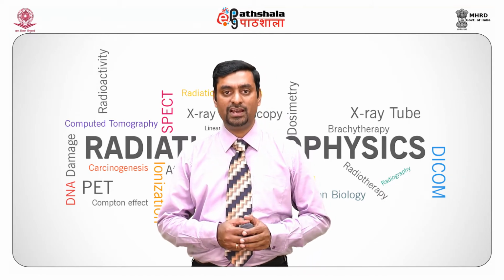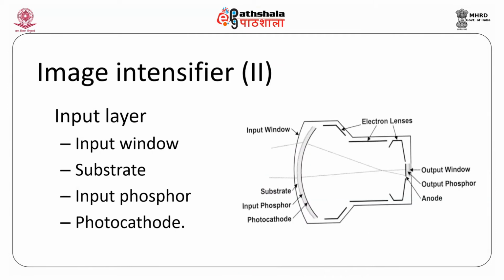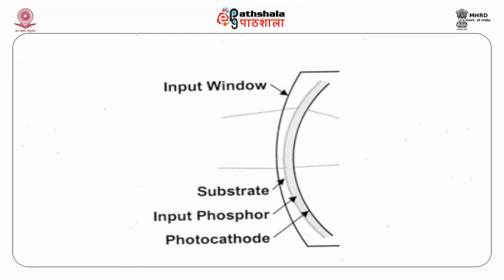Let's go ahead with the II machine. The input layer, as you see in the image, has an input window, a substrate, input phosphor, and a photocathode. The input window is curved in shape with a layer of metal or glass. When X-rays pass through the input window and the aluminum substrate, it reaches the input phosphor. The input phosphor is made out of cesium iodide crystals, or in other cases gadolinium oxysulfide. The function of these crystals is to convert the X-ray pattern into a visible light pattern.